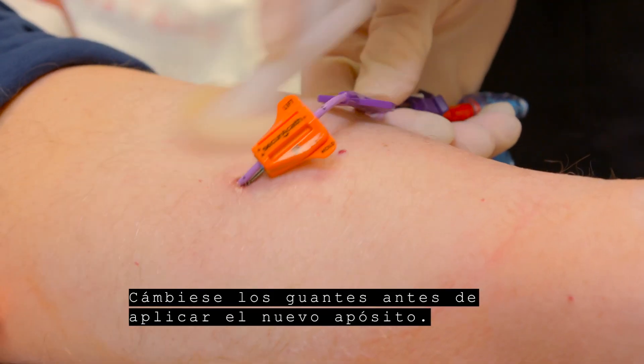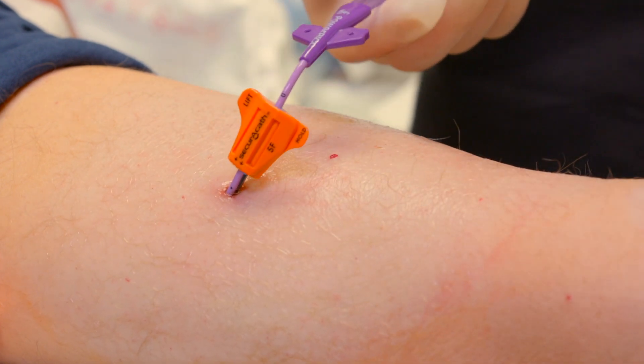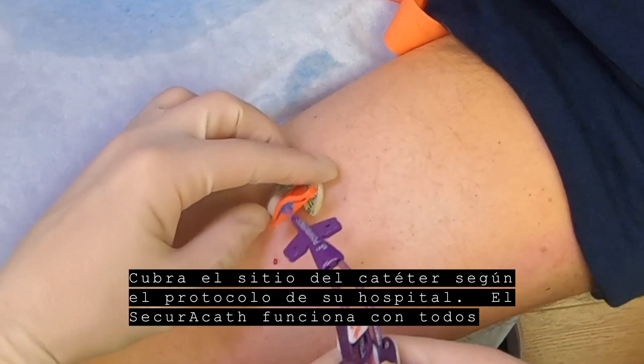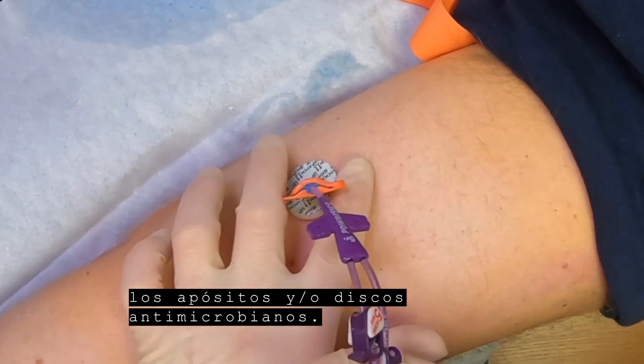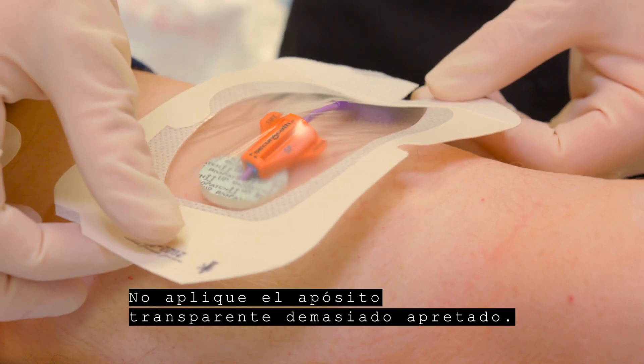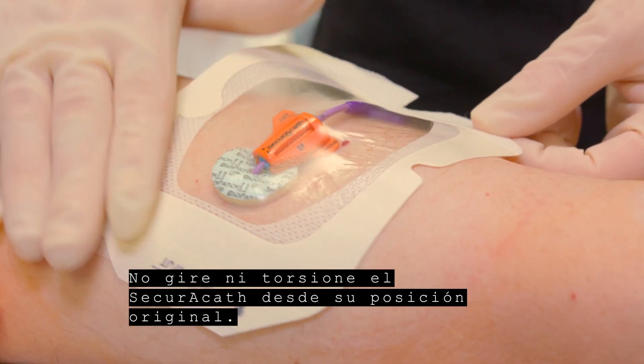Change your gloves before applying the new dressing. Dress the catheter site per your institute's protocol. The SecuraCath works with all dressings and or antimicrobial discs. Do not apply the transparent dressing too tightly. Do not turn or twist the SecuraCath from its original position.